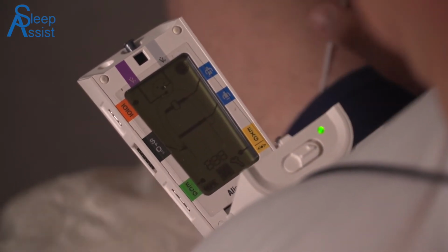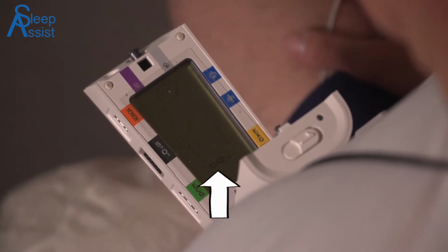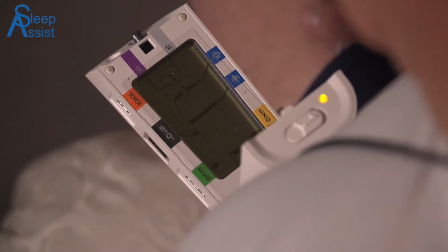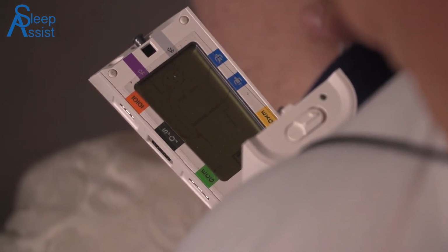The screen will display a figure of a man. A series of zeros will flash across the bottom of the screen. In a few moments, the sensor location icons will flash. Positions flashing need to have correlated sensors connected.